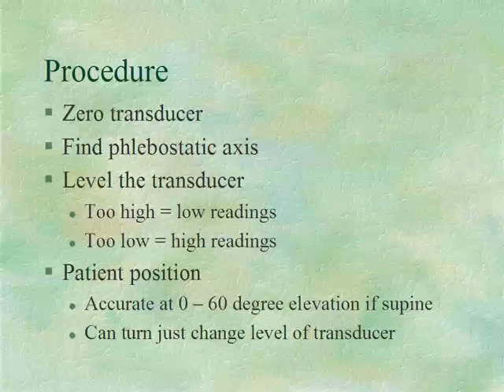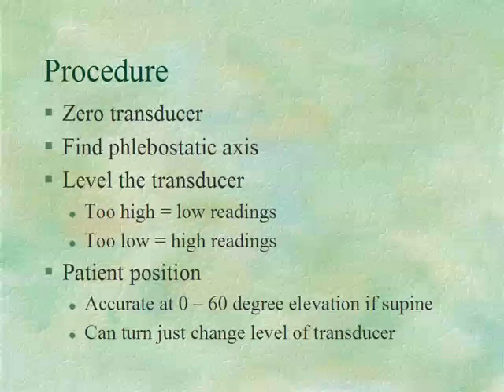There's a figure on page 357 that helps correlate the catheter position and the waveform position. It is affected by your body position. So after you change the patient's position, like if you put them supine from being up, you have to wait at least 5 minutes if they've got normal cardiac function. And if not, you have to wait at least 15 minutes before you do your cardiac output.